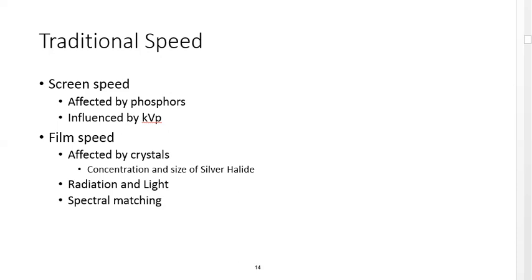And what you had in the silver halide is if you had a very large crystal, more interactions could take place on that crystal and cause a blackening of the crystal. So if you think of silver, your grandmother's true silverware, if it goes unpolished for an extended period of time, it'll actually turn black. It tarnishes. That's really what happened in films. The film basically underwent that oxidization that silver undergoes whenever it's exposed to oxygen and light.